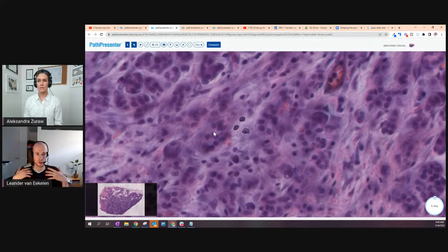That's specifically semantic segmentation. So if I wanted to do semantic segmentation, I would have to annotate every freaking pixel of this thing. Exactly. The main takeaway from semantic segmentation is that you do not differentiate between discrete objects. You just segment: this pixel is cell type A, regardless of what specific cell it might belong to.